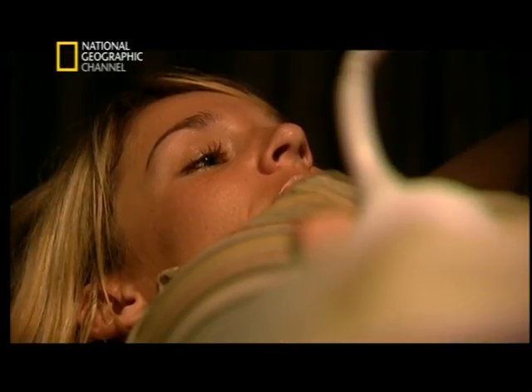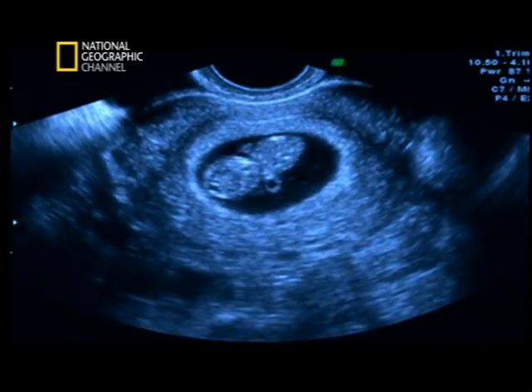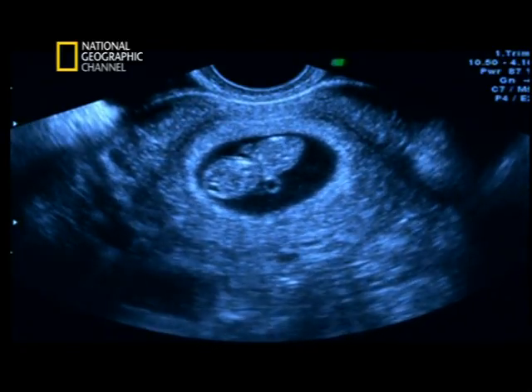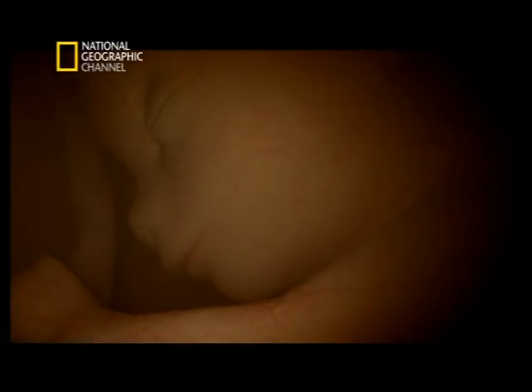And it'll all make sense to you when the baby starts to move. Okay. The pictures are produced by sending ultra-high frequency sound waves, far too high for us to hear, from the probe into the body of the mother. That's right. The waves penetrate through internal tissue, passing easily through fluid areas like amniotic fluid, but bouncing back strongly off solids like bone.